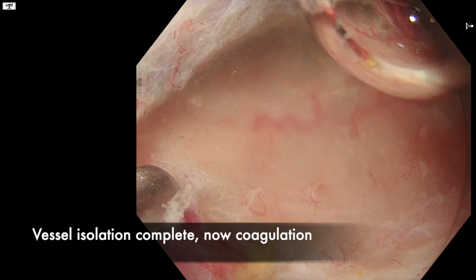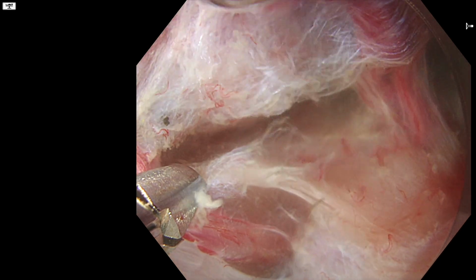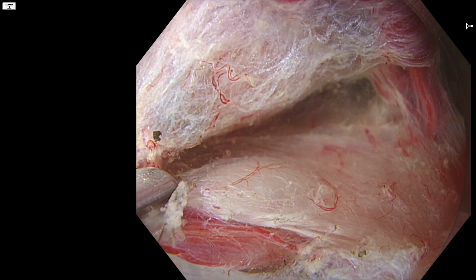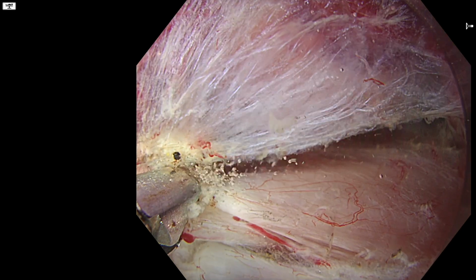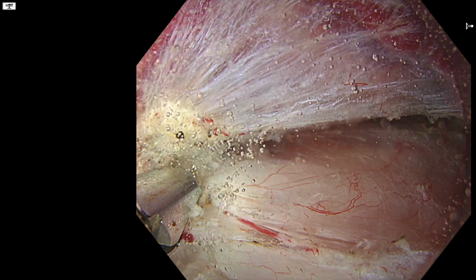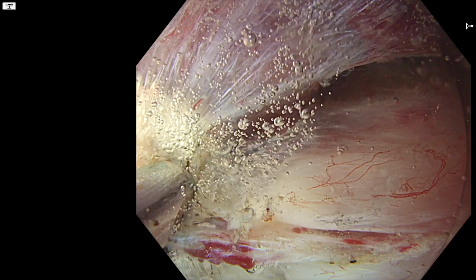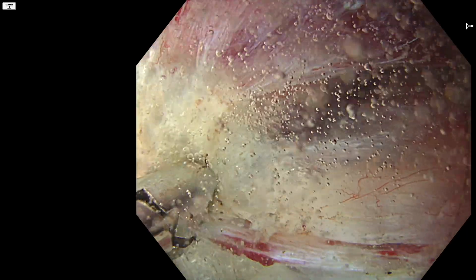Okay, so for coagulation, I usually bring the power up a little bit when under immersion. I get a sense that some of the heat or the energy is dissipated with the immersion, so it's usually 100 watts minimum I'm using here, and you have to be a little more patient as well. Because a lot of the time, it's happened before, the vessel looks completely sealed, then you cut through and it starts bleeding. So it's best to take your time, I think.